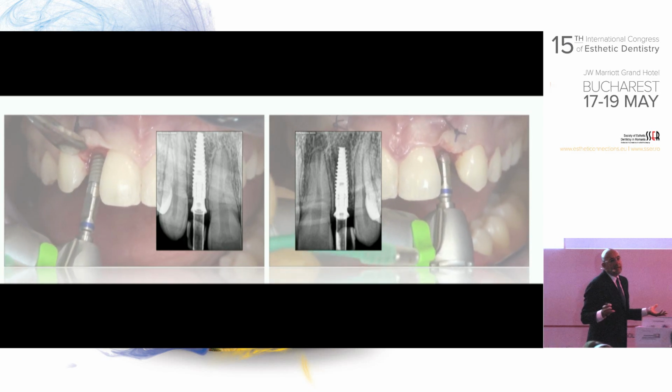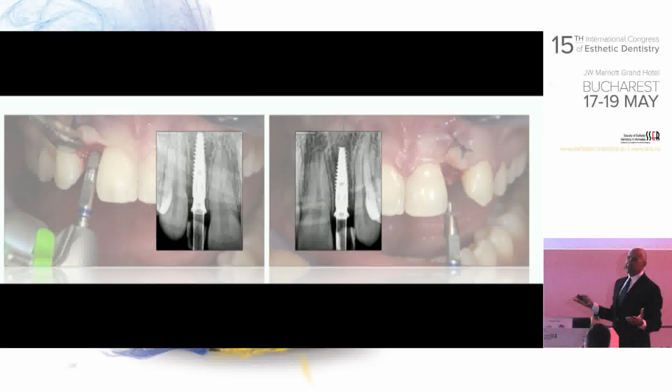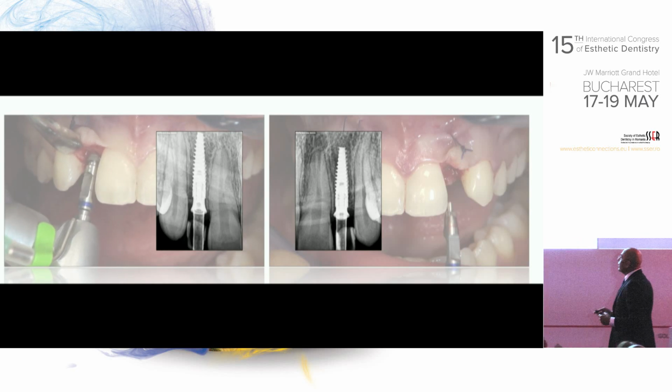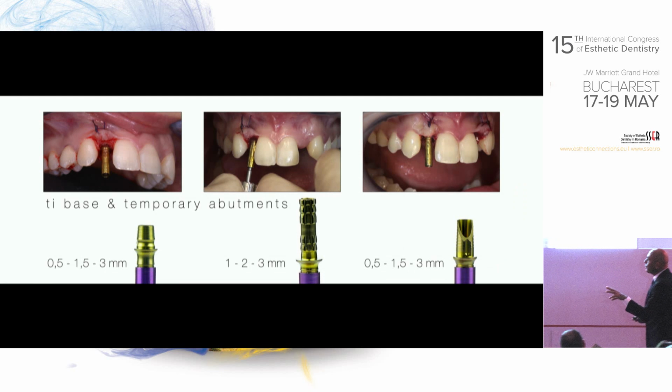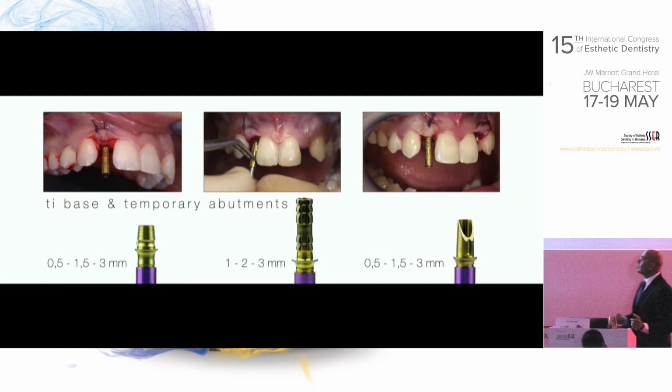And they all admit it. They said without the guide, luckily it would be like this, but never repeatably in every case. So this is the implant placement. Now I get the green light for immediate loading.